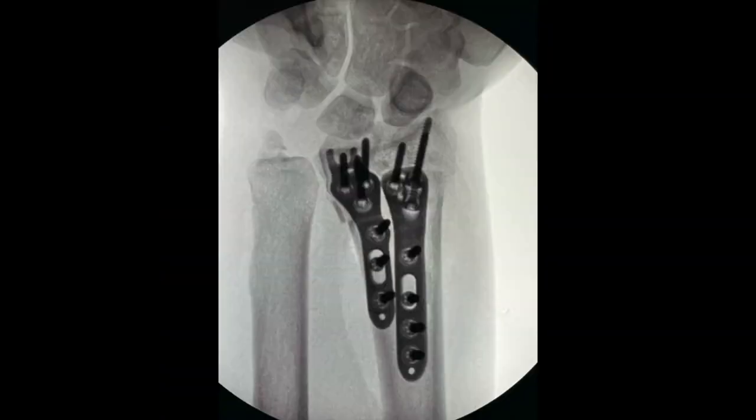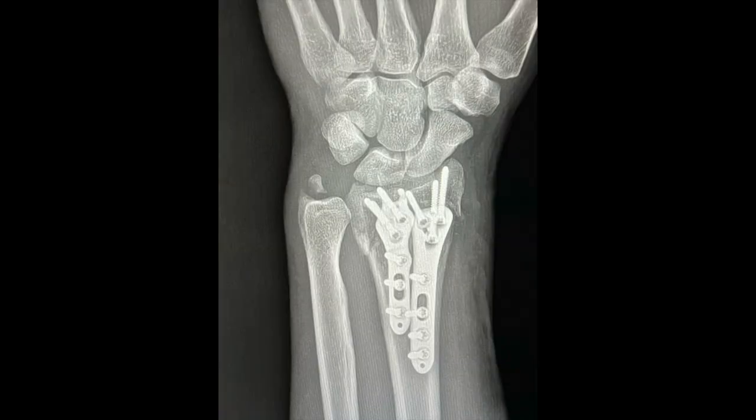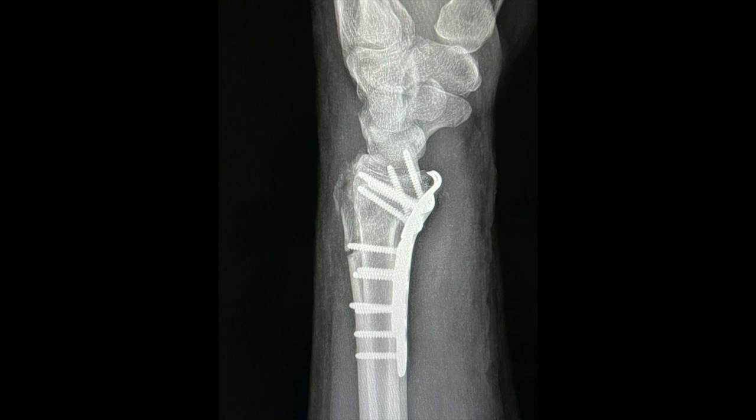Fluoroscopic views show excellent anatomic reduction to the very distal fragments in both the AP and lateral planes. Final radiographs again show early healing and anatomic reduction to the fracture fragments.